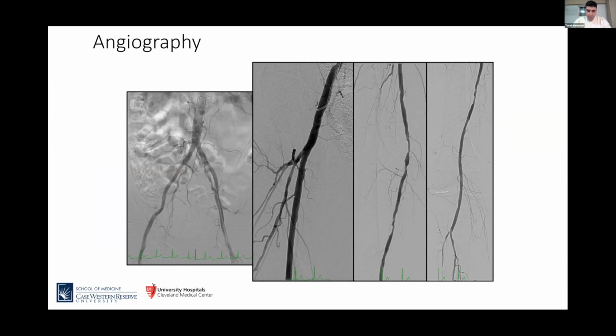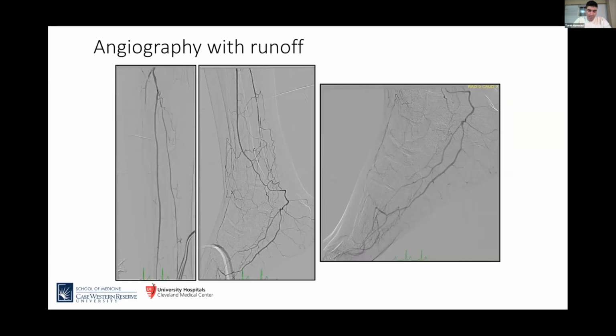Here's his angiograms. We came from contralateral side, left femoral access, pigtail. You can see the iliacs and femoral without any significant disease. More selective images in the right panel. You can see the common femoral look okay. The SFA proximal segment, profunda looks okay, but you can see that in the mid to distal SFA, there is multiple eccentric stenosis up to 70–80%. Now, below the knee, the AT is occluded. TP trunk is okay, peroneal is okay, PT with severe stenosis distally. And you can see the plantar artery in the foot and dorsalis pedis with some reconstitution.